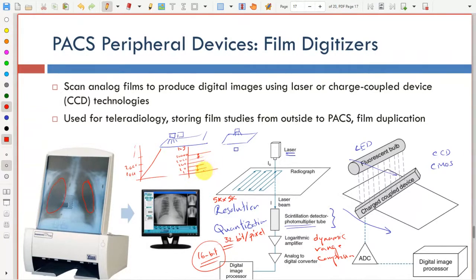So you expand the low intensities and compress the high intensities, but you still have differences between the different intensities. If a place in the image is higher than another, it's going to be the same way in the logarithmic compressed image.